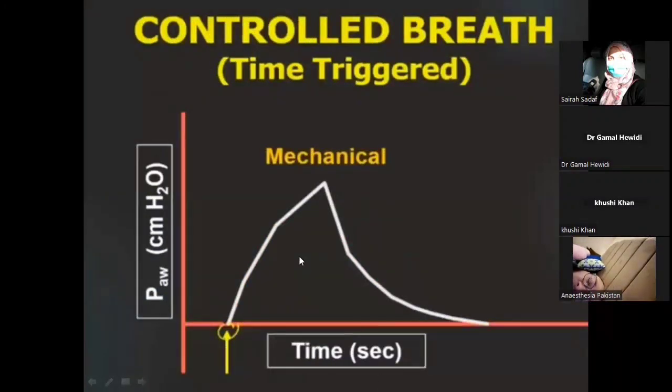Let's go forward. Now, what is this? This is a controlled breath. You can call it a mechanical breath. You can call it a ventilatory breath. All right? Mechanical breath, controlled breath, or ventilatory breath, all are the same things.